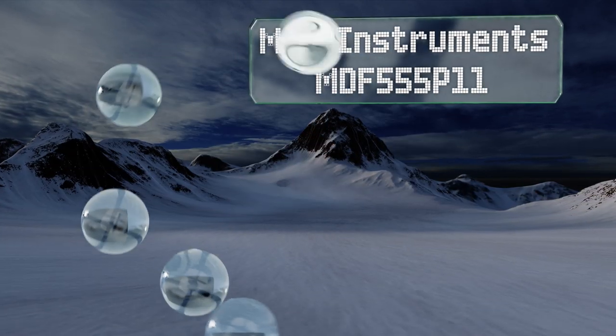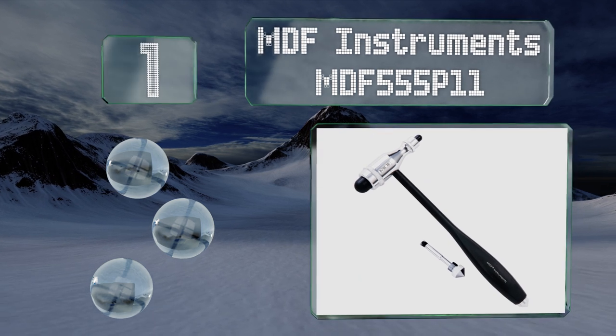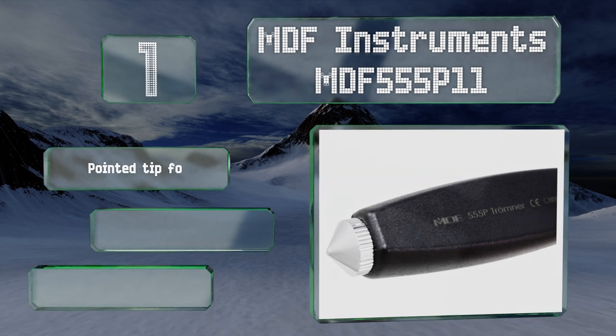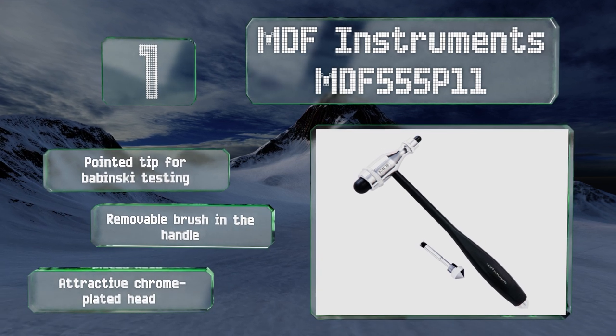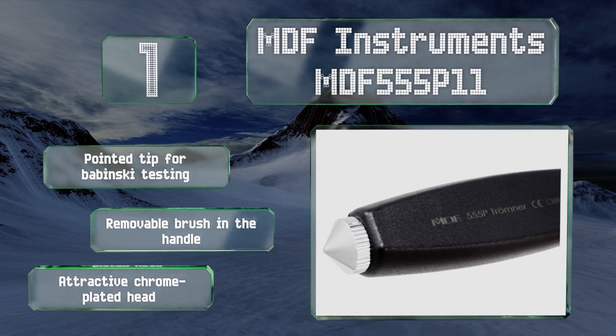Taking the top spot on our list, the MDF Instruments MDF 555 P11 is a high quality four-in-one mallet Trömner model that can easily be used to elicit reflex and cutaneous responses. It features a thick rounded head on one side and a smaller one on the other for more precise tapping. It comes with a pointed tip for Babinski testing, a removable brush in the handle, and an attractive chrome-plated head.